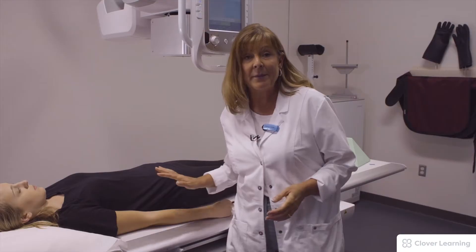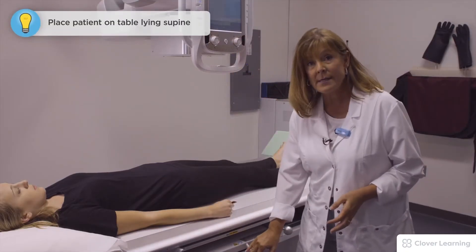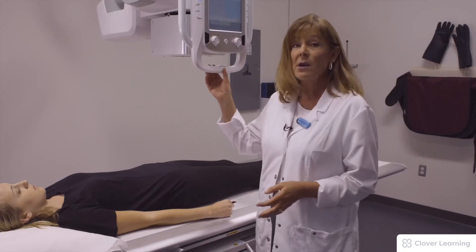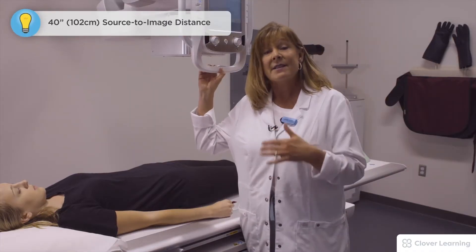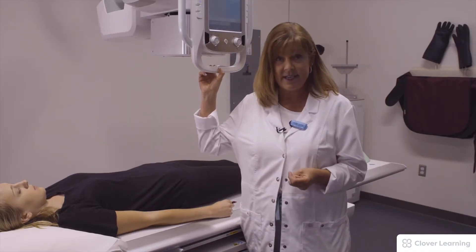I have my patient on the table supine and the IR is in the bucky tray. All my locks are engaged and I am set at 40 inches SID.